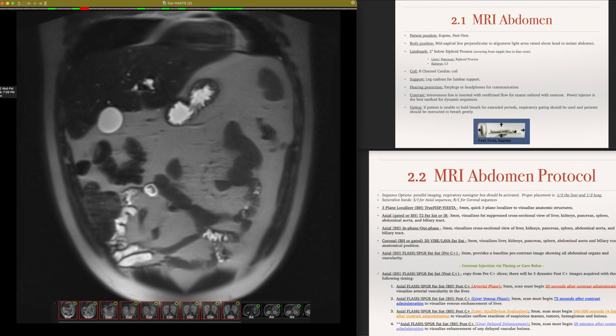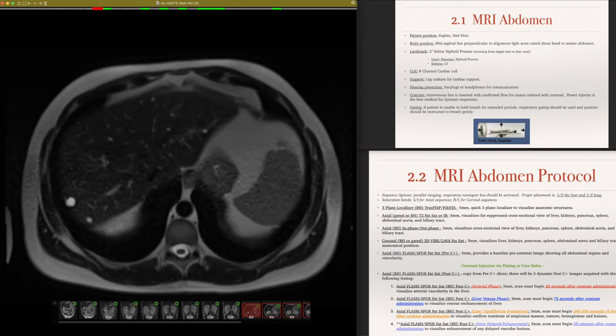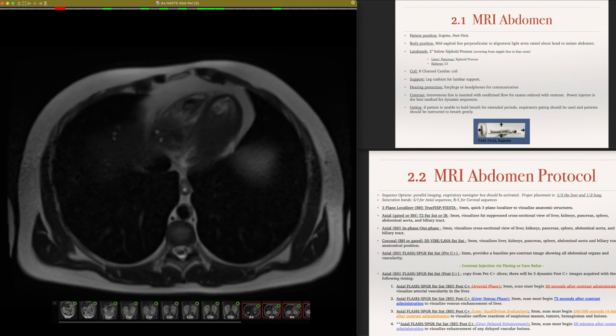So let's move it over to an axial. Axial imaging, also known as short axis, I like to refer to as slicing bread, right? Wonder Bread, think that. There's a slice throughout the body, for those folks that are prospective technologists watching. Axial is cutting you from head to toe, all right? So it's looking at you from the top to bottom, or in tech terms, superior to inferior or inferior to superior. So let's start from the top and work our way down.